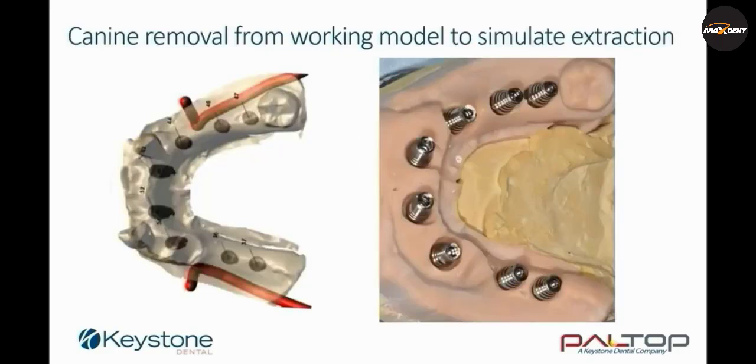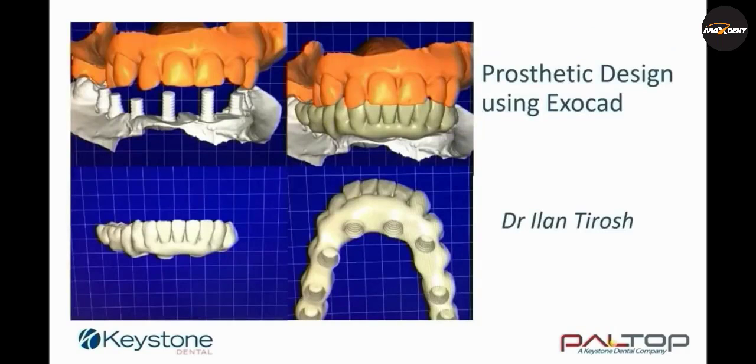The 3D printed model was delivered. The canines were extracted from the model. Multi-units were connected to the DIM analogues, and temporary titanium sleeves were screwed onto the multi-units. Dr. Tirosh was now able to scan the multi-unit abutment sleeves, together with the working model in the opposing arch, and to design a hybrid screw-retained bridge. This was done using ExoCAD.